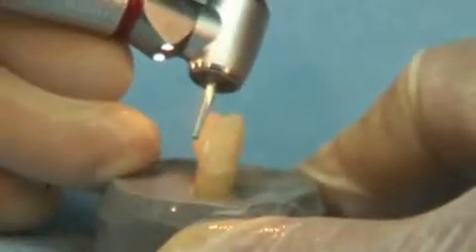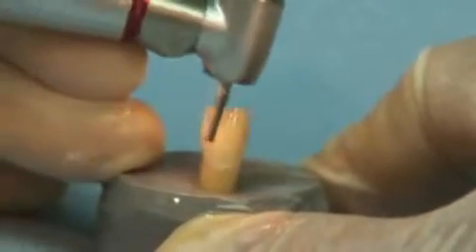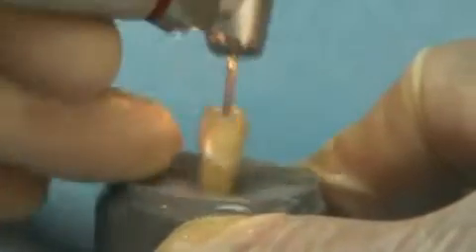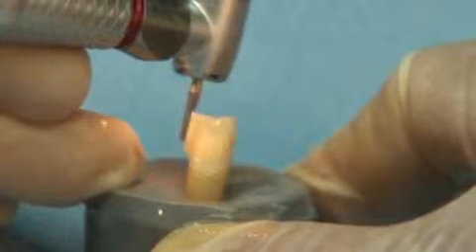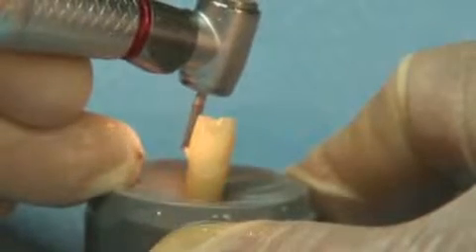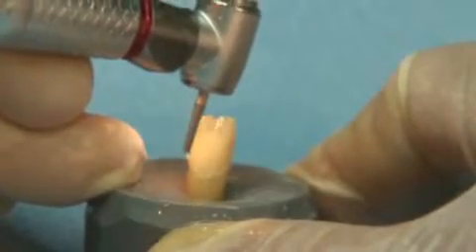As you can see, the exact shoulder development with the Great White Ultra 847-018 is created very efficiently. The Ultra eliminates any internal line angles that may cause undue stress on the restoration once it is placed. Diamond instruments are not able to produce the precision preparation that is seen here with the Great White Ultra.